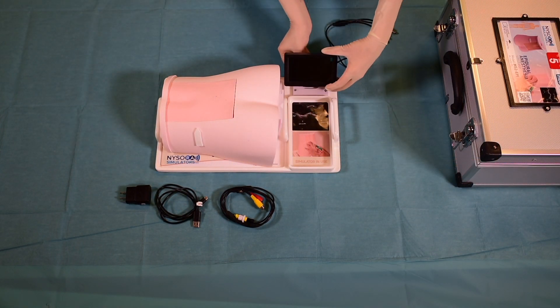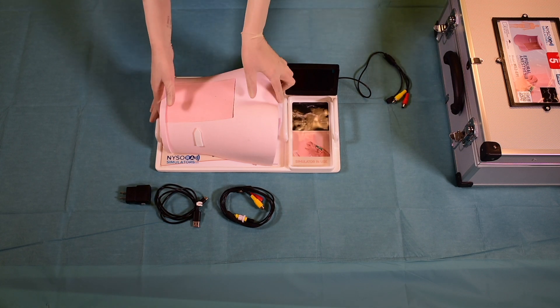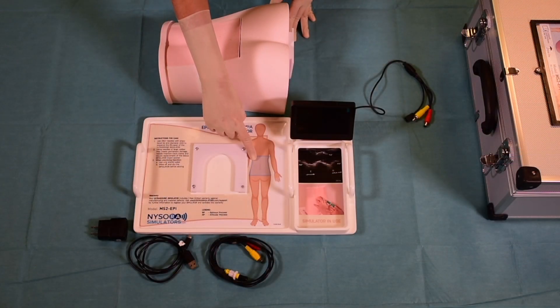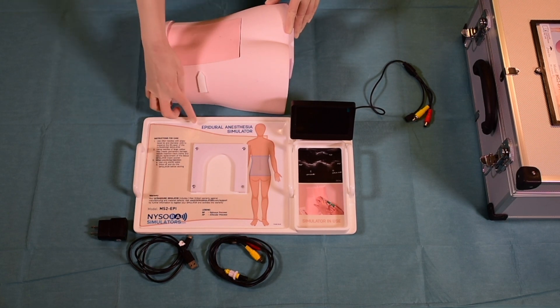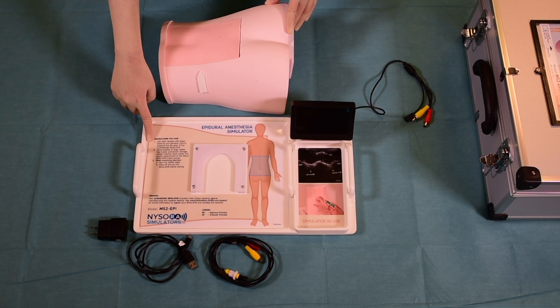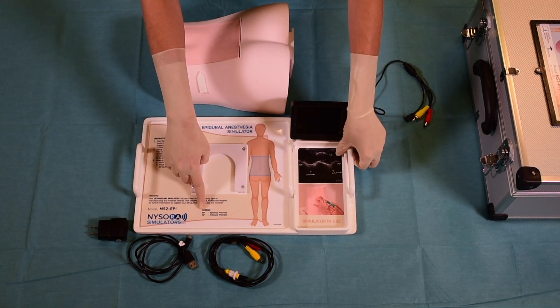An optional camera is fixed to the tray which allows the operator to visually confirm needle and catheter placement in the proper space. The ultrasound tray contains clear instructions on the part of the body that the simulator belongs to. Instructions for use and care are also provided, as well as abbreviations that are used in the ultrasound image.